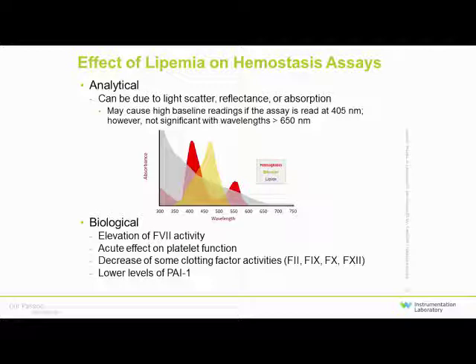So the analytical changes can be due to the light scatter, the reflectance, or their absorption due to the lipids. It can cause high baseline readings if the assay is read at 405, but it's probably not significant with analyzers that have wavelengths greater than 650.